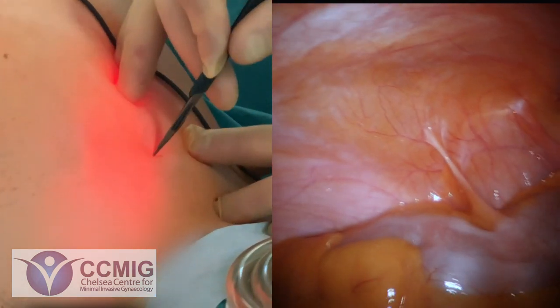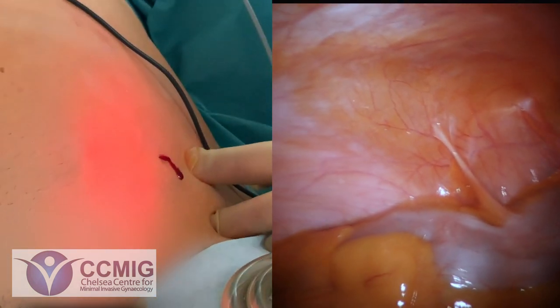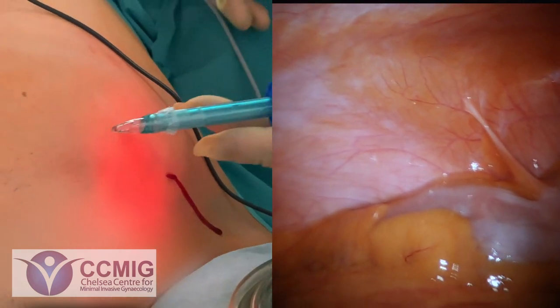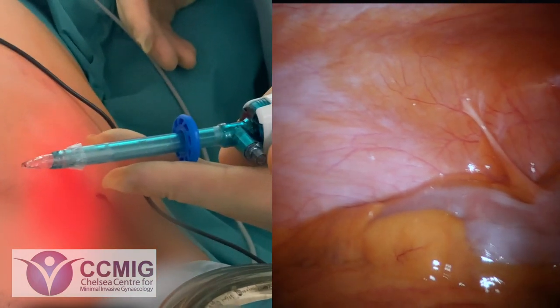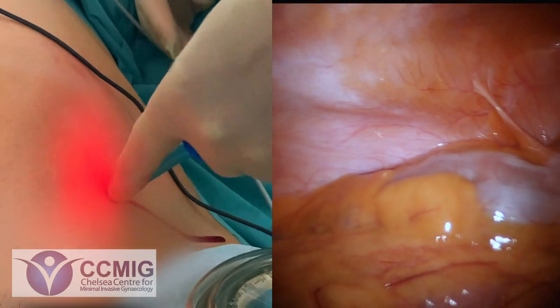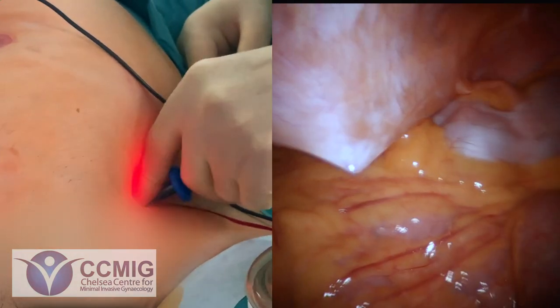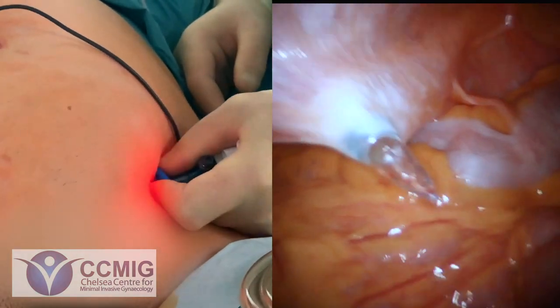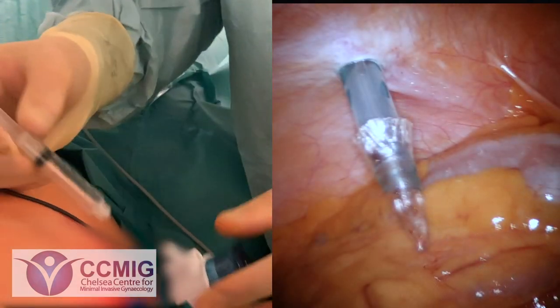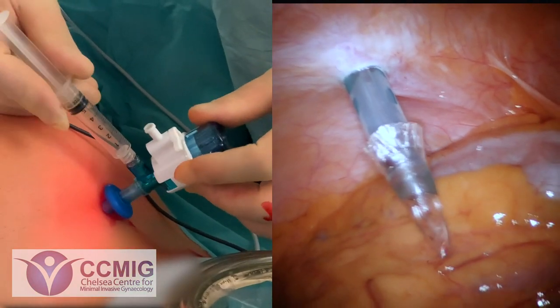So another five millimetre incision on this side. There's a small amount of bleeding there, but we know on average there's far less blood loss with a laparoscopy than there would be with a larger abdominal incision. And that port goes in nicely. Here we see the balloon being inflated to allow us a really good seal so no gas leaks into the operating theatre.